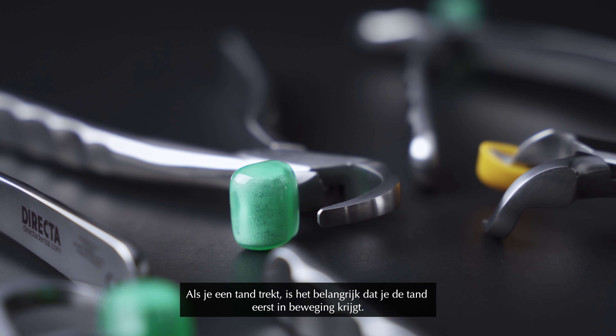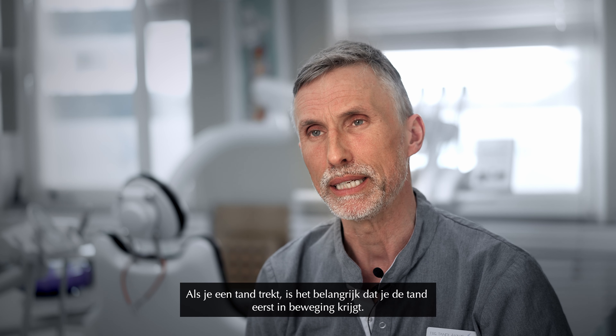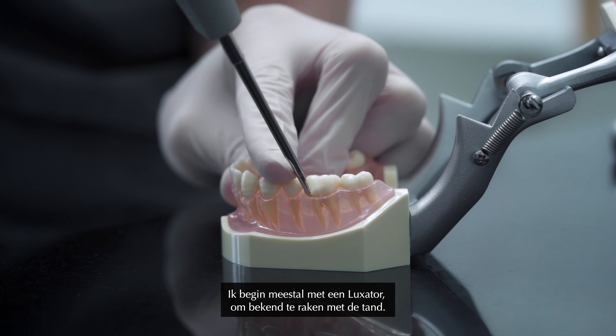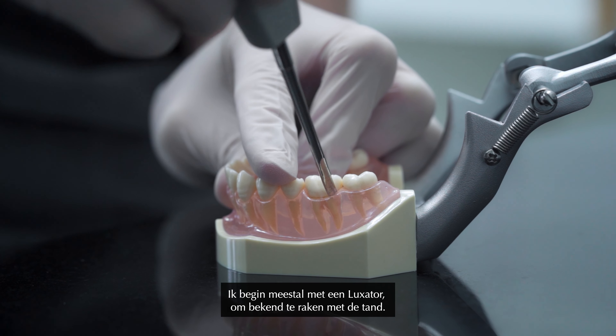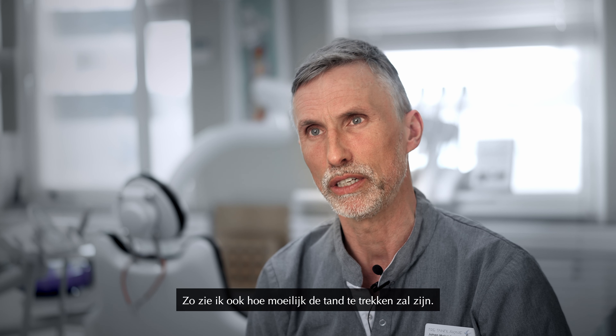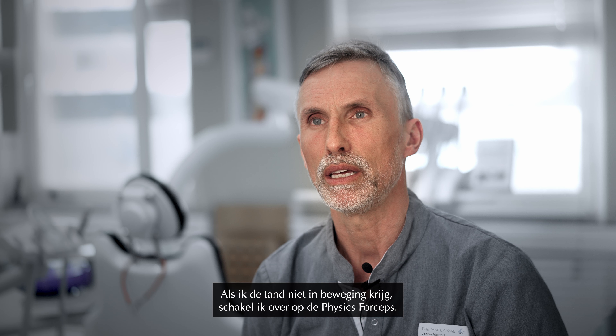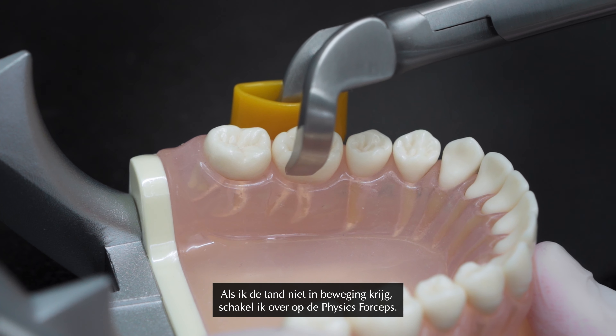When you take out the tooth it's important that you create mobility in the tooth first. I usually start with a Luxator to just get to know the tooth, feel around and see how tough the tooth is going to be. If I don't get any mobility in the tooth, I then go to the Physic forceps.